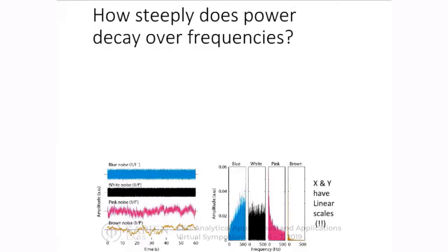For some of you that are familiar with sound processing, these examples might be familiar. Otherwise, it's just as a reference to know that signals can be prototypically described as belonging to one of these categories, depending on essentially the appearance, whether it's hairy or has a slow fluctuation.